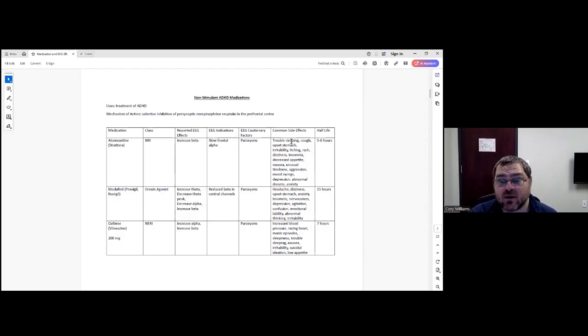So for Strattera, I always ask, when's the last time you took your medication when I'm doing an EEG for someone? And say if they're telling me they take Strattera and they took it 3 hours ago, okay, well, it's not even one half-life. I expect to see some trace of that. But if they tell me, oh, I took it yesterday, well, that's 24 hours. That's 4 half-lives. I should expect to see, if we're going to increase beta, that effect should be much, much smaller. So it's important to know when they took their medication. And I definitely ask that anytime someone does an EEG.